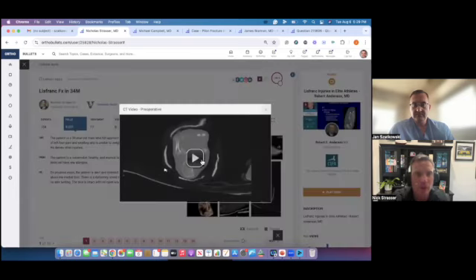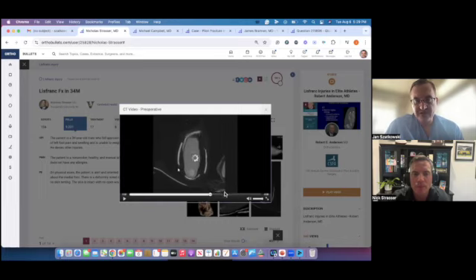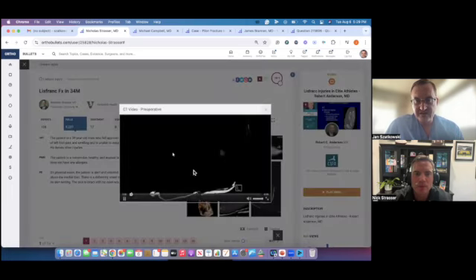I don't know if that CT scan will play or not. Looks like it will. You can see some small avulsions, but mostly ligamentous in nature. And you can see how it's completely dislocated. You basically have the base of the first metatarsal articulating with the middle cuneiform. Yeah, which is what you see on the X-ray too. I don't think there are any surprises with the scan. Nope. Let me just see the sagittal here.